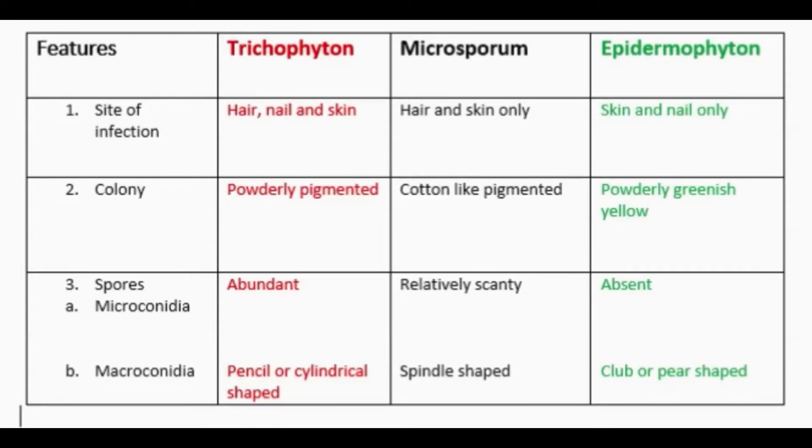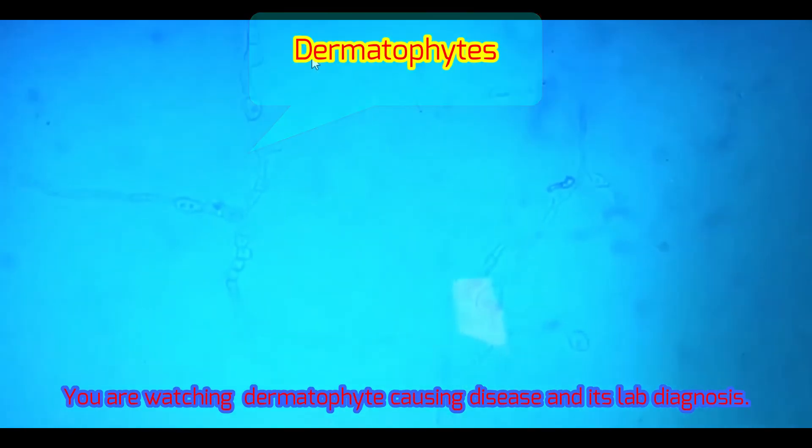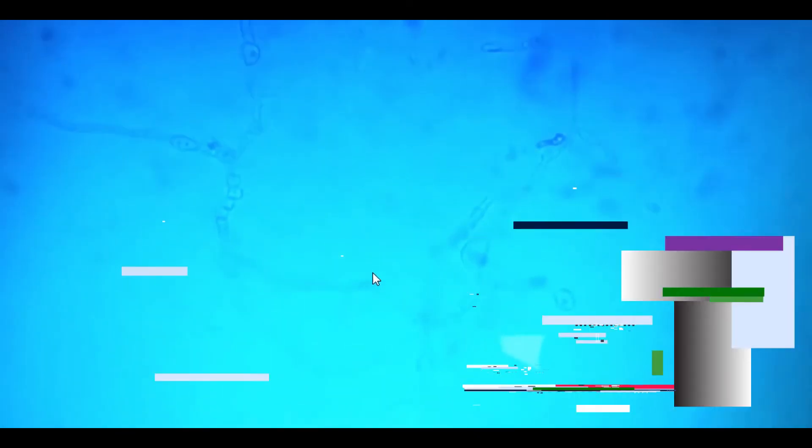Let's watch the clip for practical identification. Here we can see powdery greenish-yellow colonies. Now about spores — in this field, microconidia are lacking, no microconidia at all.